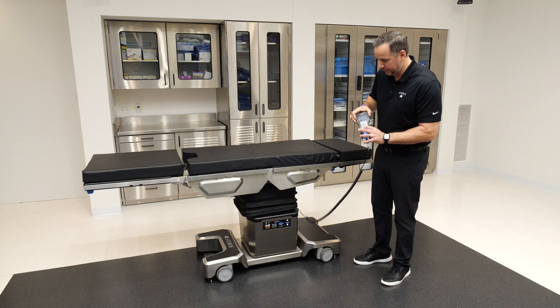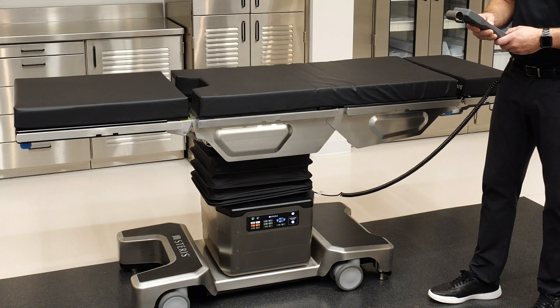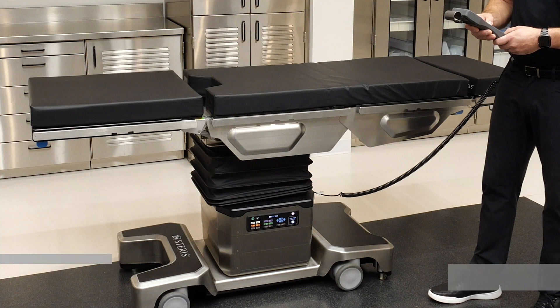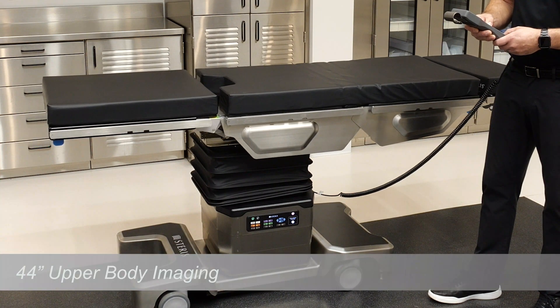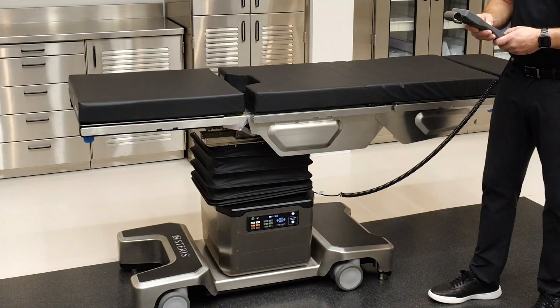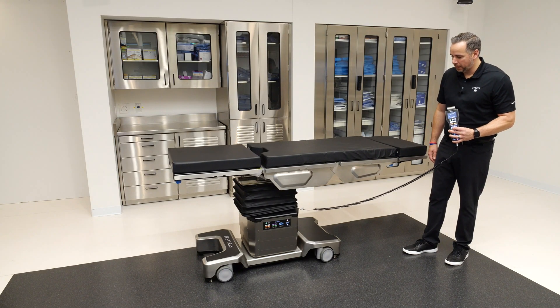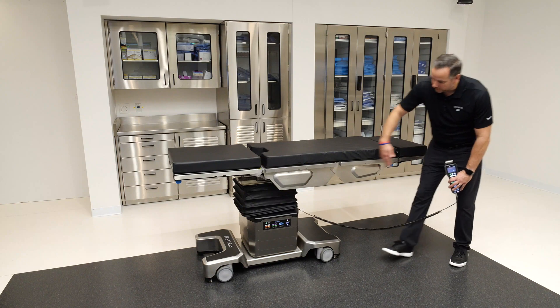On the other side, towards the head, 22 inches of slide in the other direction produces a 44-inch imaging window — great for upper body exposure from the head down through the pelvis and into the legs, as demonstrated right here.